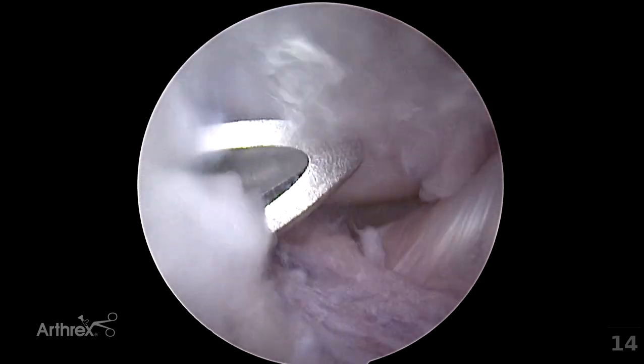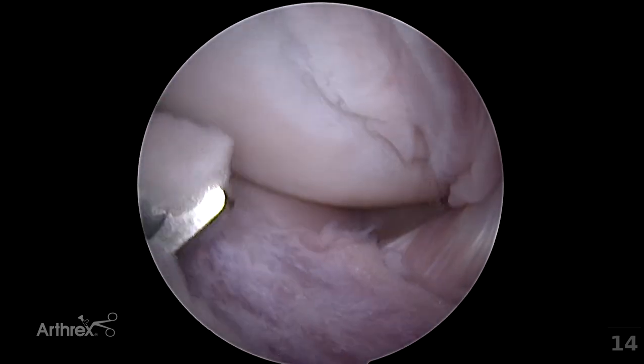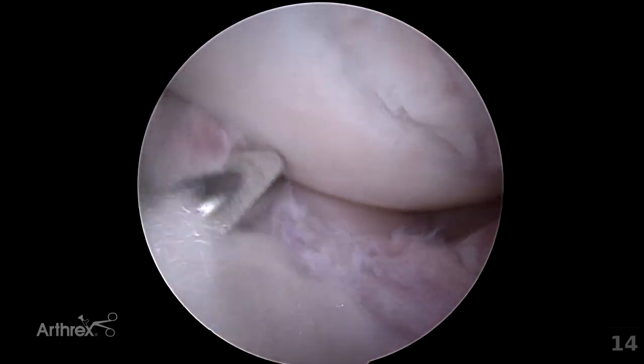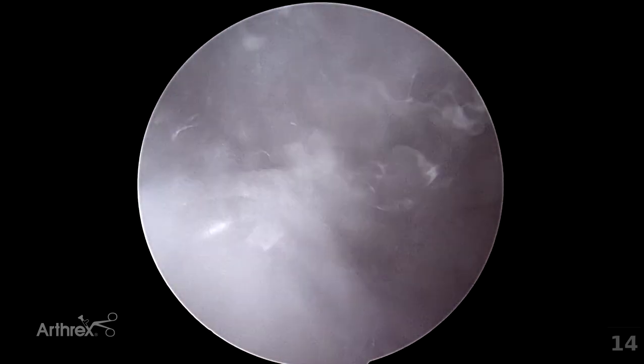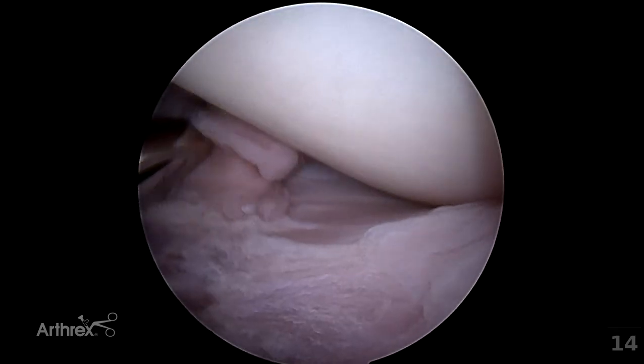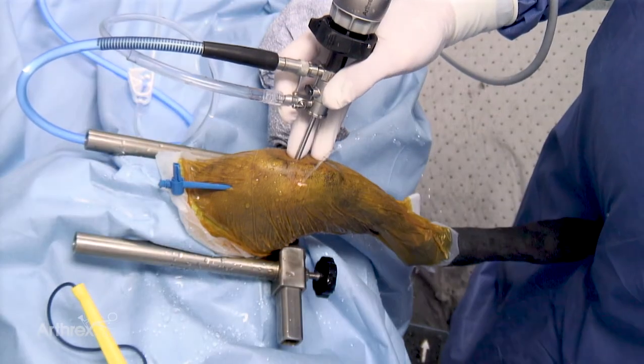Removal of the intra-articular fat at this position will maximise visualisation of intra-articular structures. The degree of shaving in this patient is now appropriate. It is helpful to remove some of the fat around the instrument portal on the medial aspect and laterally to assess if there is fat impinging upon visualisation. The shaver can now be removed.